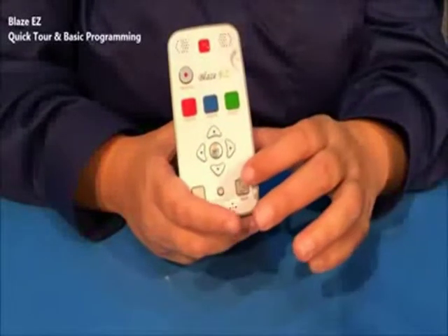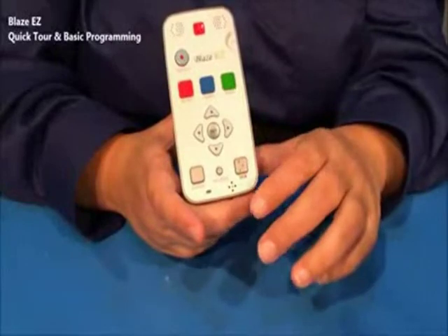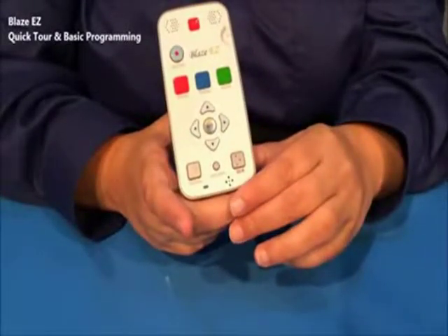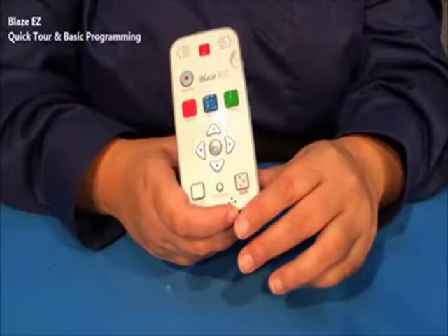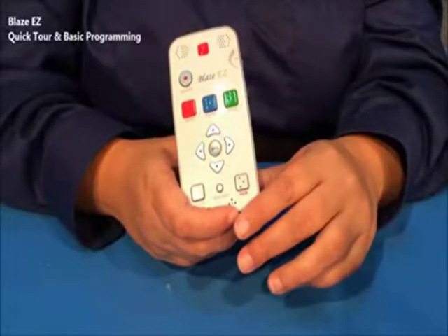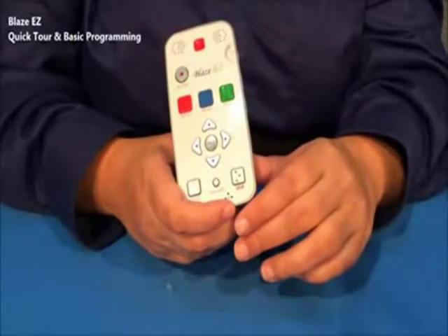Below the navigation pad is another row of 3 buttons, 2 square buttons with a dot-like button in the center. On the left is a square button with no label, which is the cancel button. You can use the cancel button to cancel out of a program or a menu, or to cancel an option, or when you're in a situation where you have to answer a prompt, yes or no, the cancel button will actually indicate no. In the center is a dot-like button, which is the Explorer button.